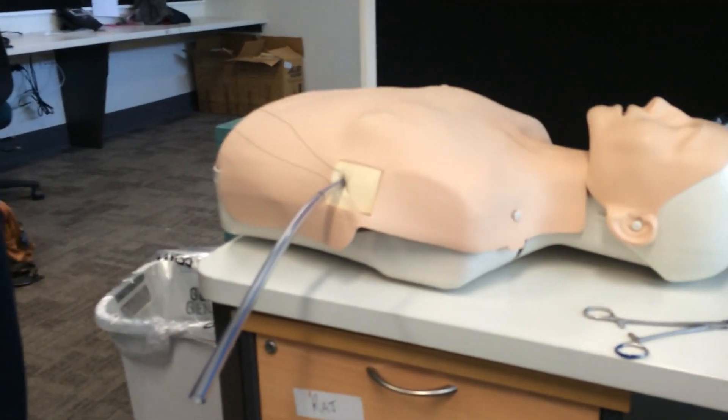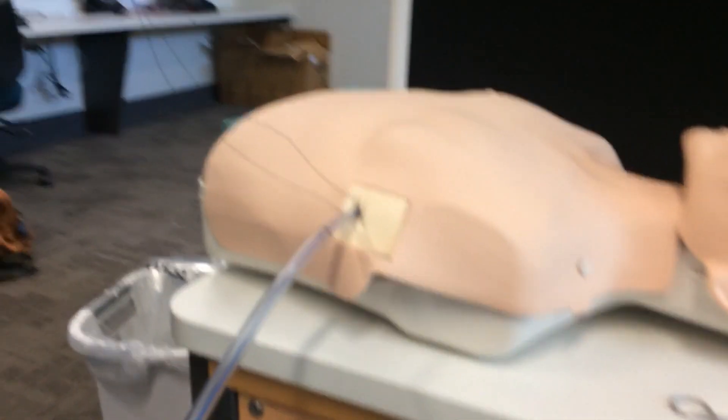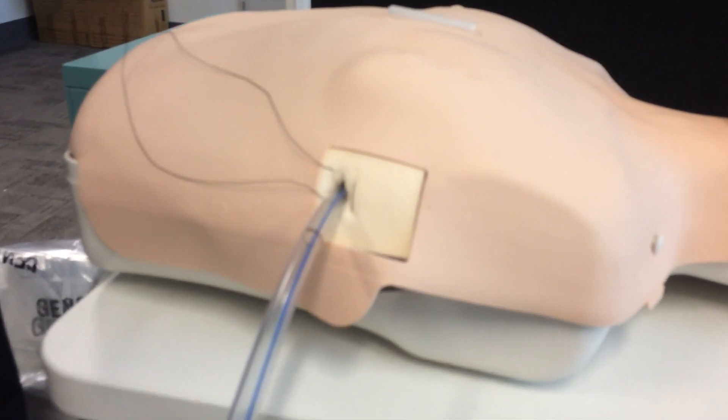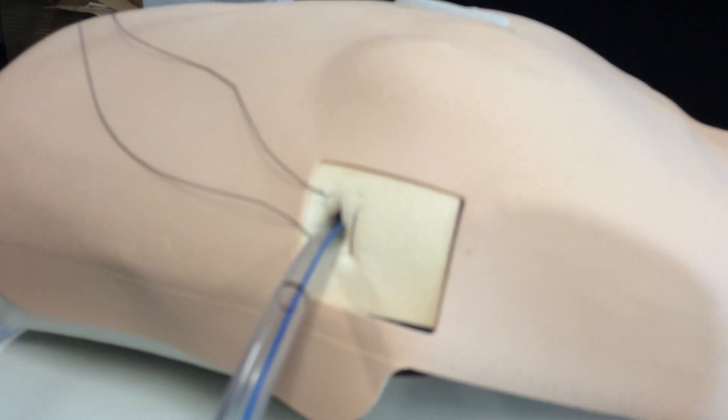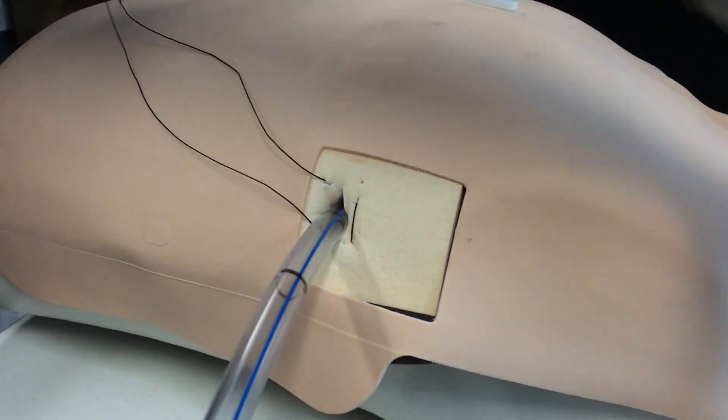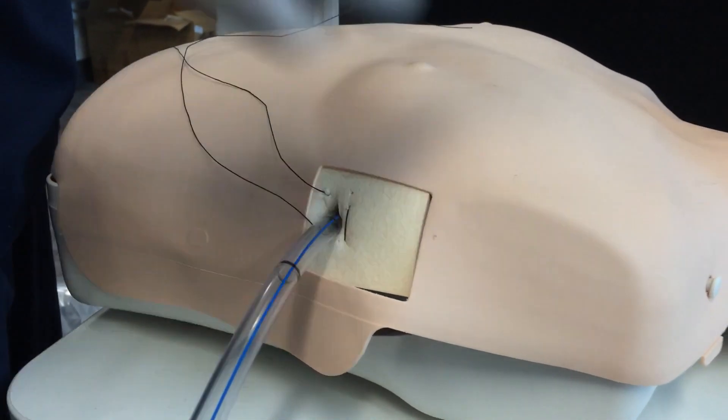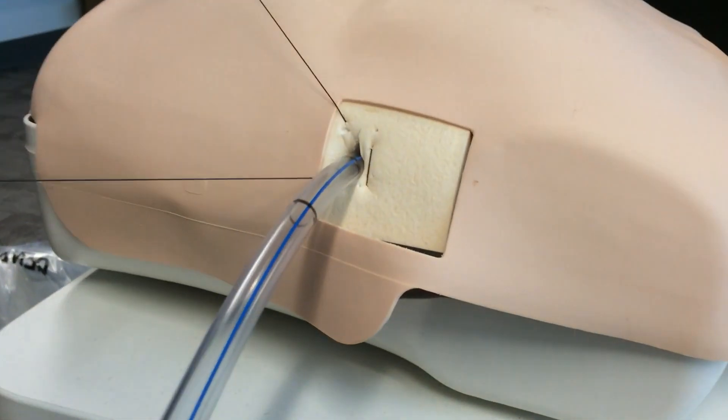This is called the Joburg Knot. It was taught to me by a pre-hospital doc in the UK and it's a brilliant way of securing your trauma chest drains.